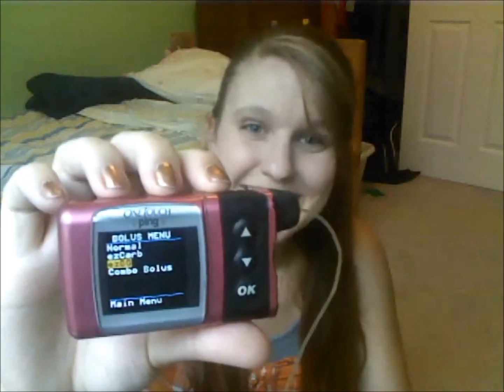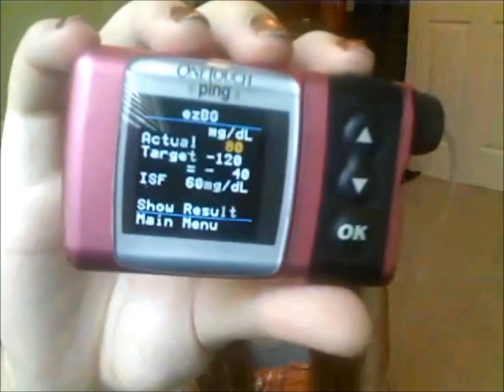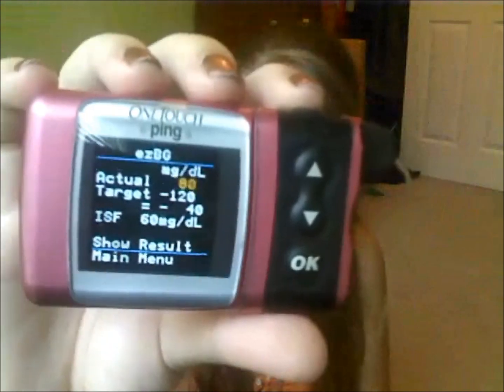The third option is called EasyBG, and they really like the acronym EASY. Woohoo, funny. But yeah, so this one is easy blood glucose. And so you can just go ahead and put in your blood sugar, and it starts you at 80. And you can just go up or down from there. So let's say I was 150.